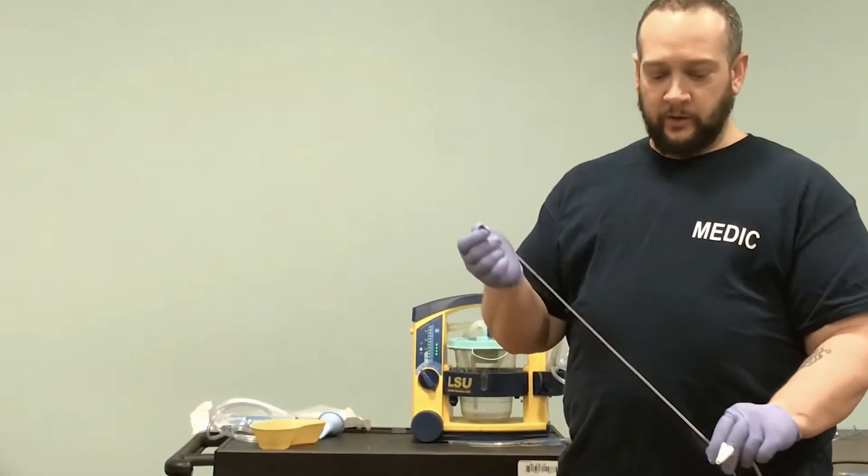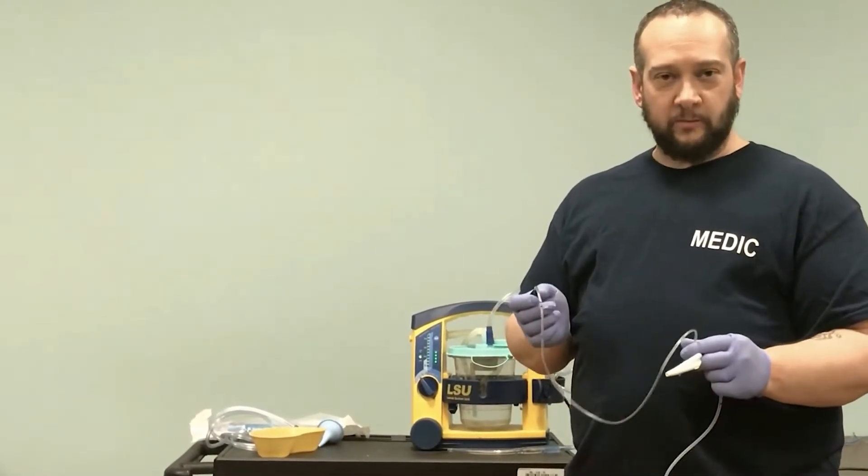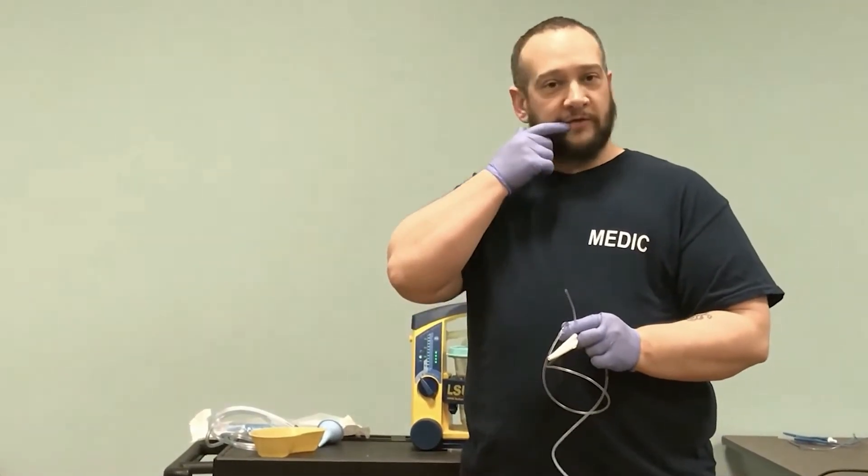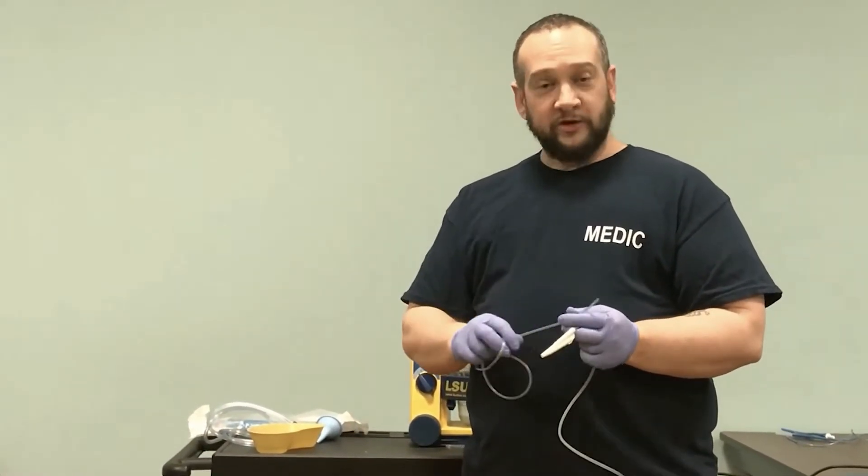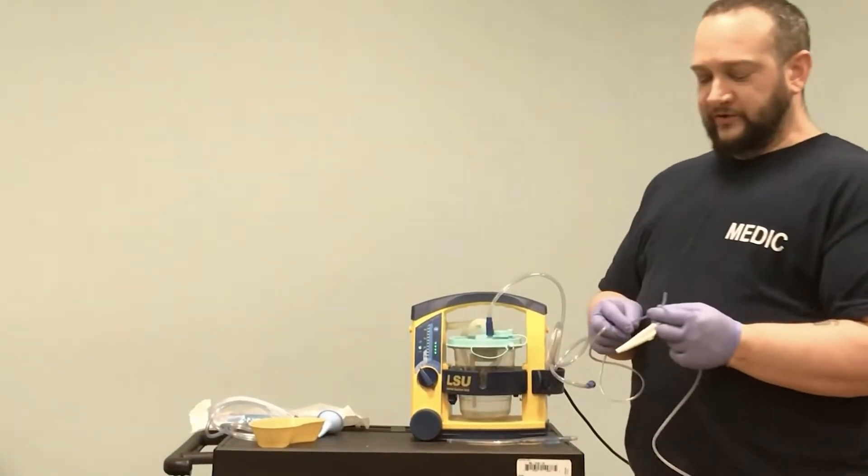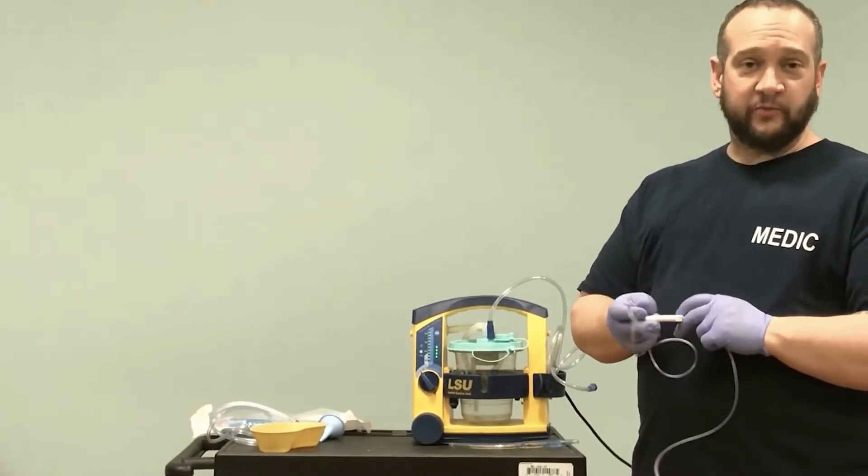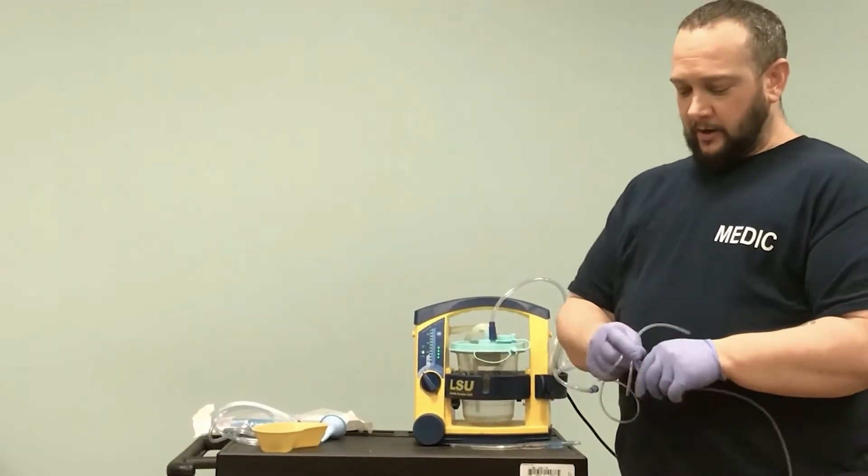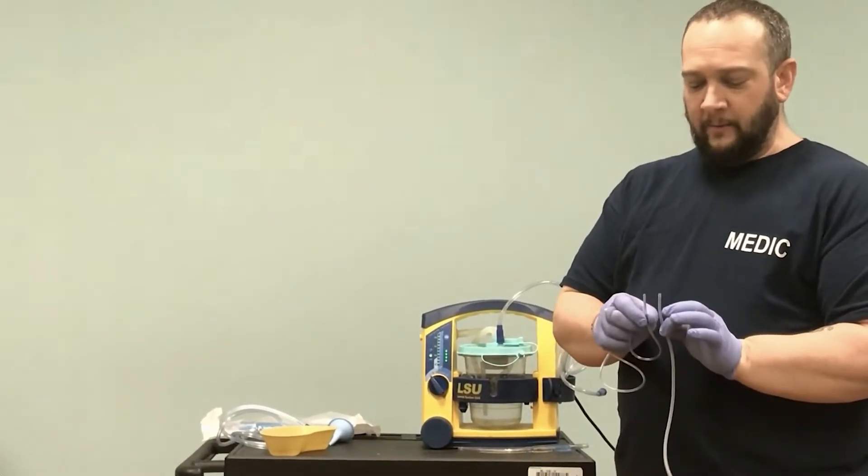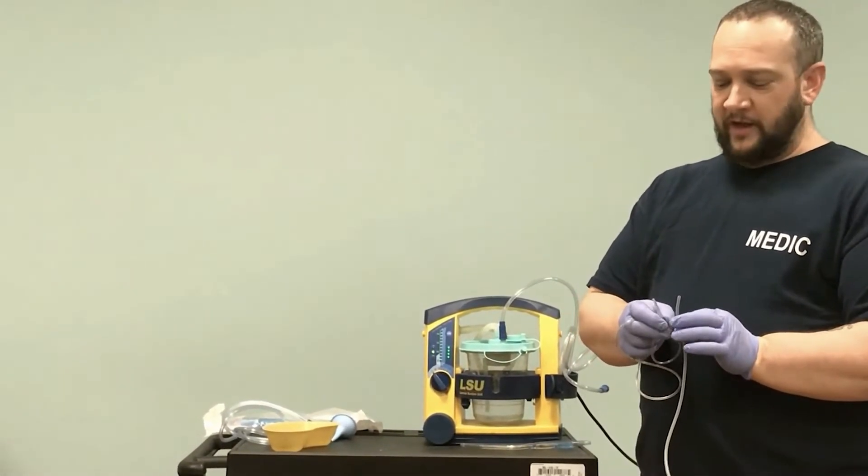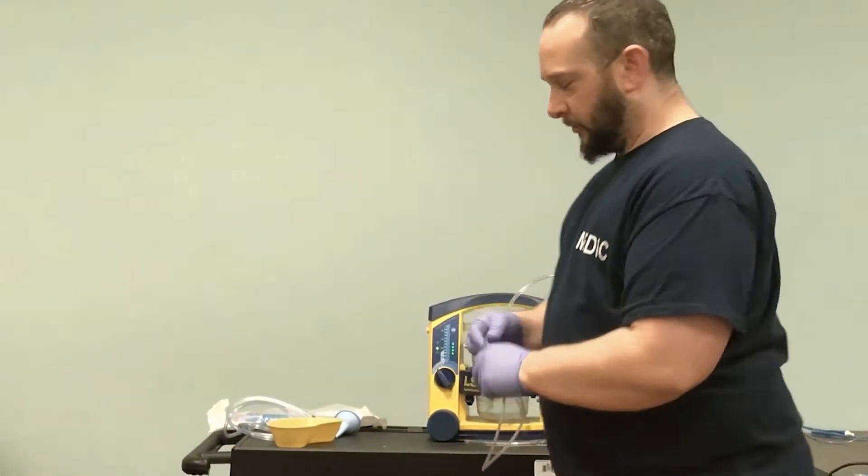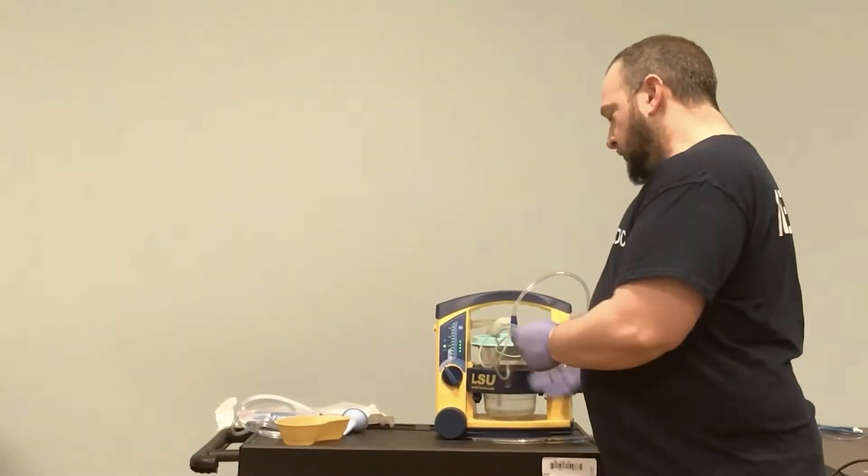Just like the Yankauer, this attaches to our tubing device, and this is the thumb port. We'll have a predetermined length, measuring from the corner of the mouth to the corner of the ear, the same as OPAs. When we look at the internal diameter, if we have thick secretions or food particles, this won't be conducive to getting that out.